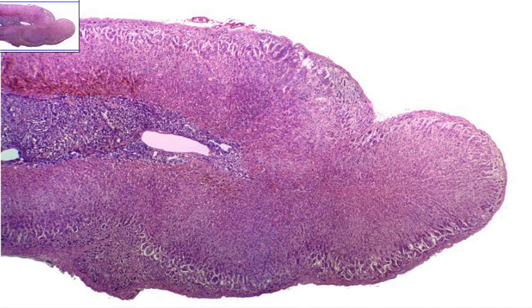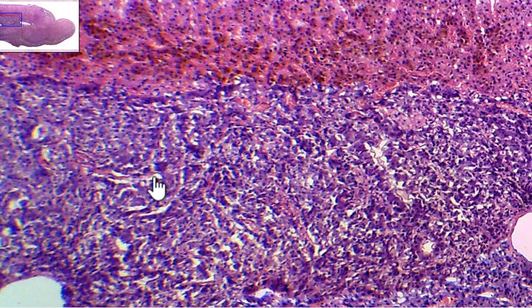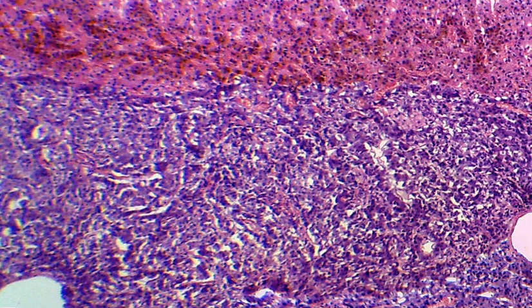Now, zooming in, we can see that this middle part right here is the medulla. The medulla is going to produce two different hormones that are kind of important, epinephrine and norepinephrine.